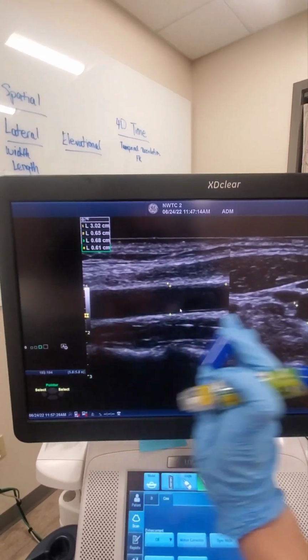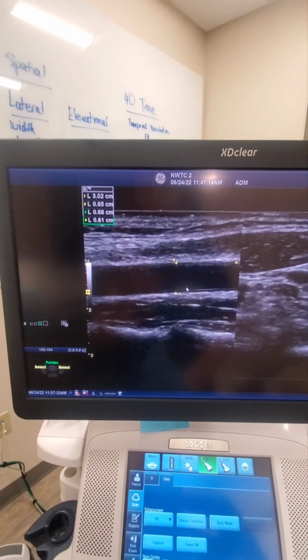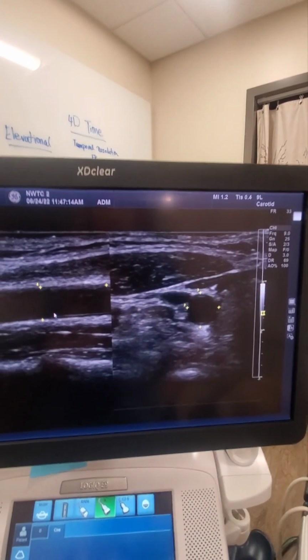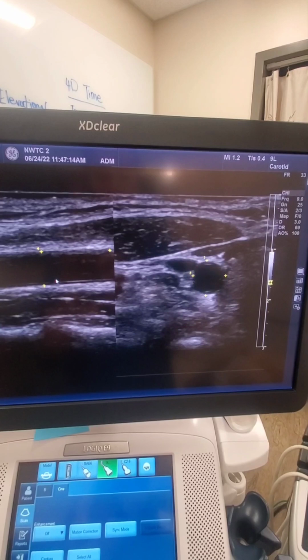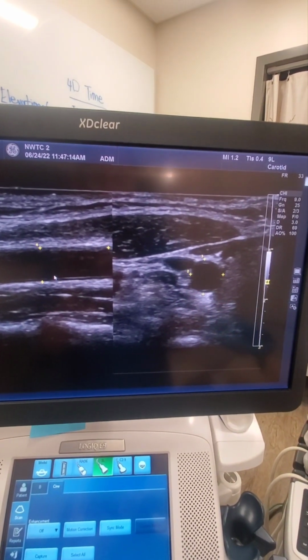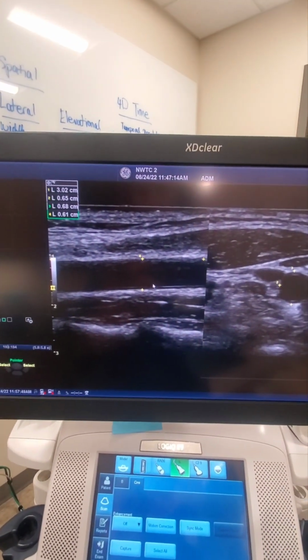Per each image, I'm showing only 2 dimensions, length and height, or width and height. There is a dimension as I'm scanning that I am not showing, because I am showing what I could print on a piece of paper. I'm showing 2 dimensions right here in either one.